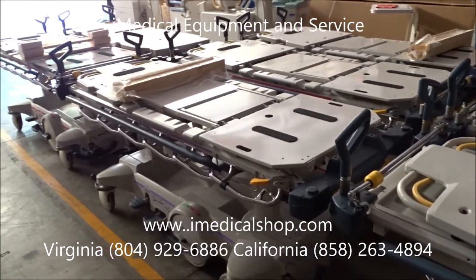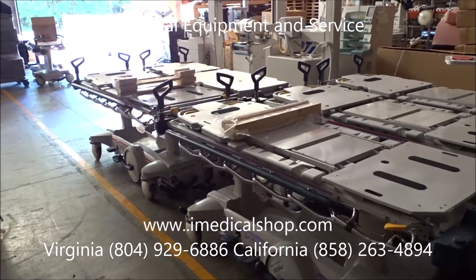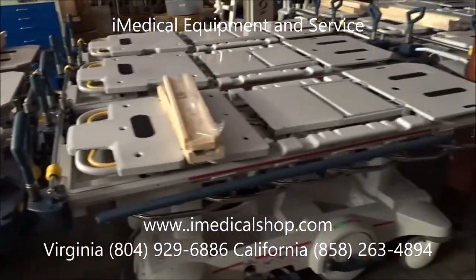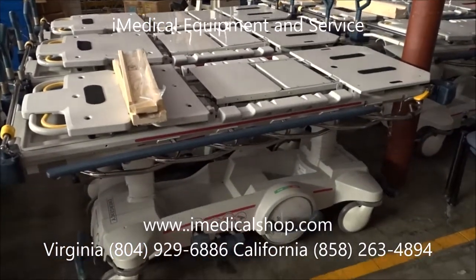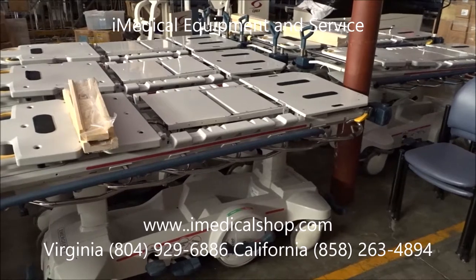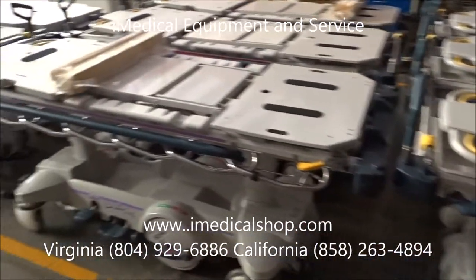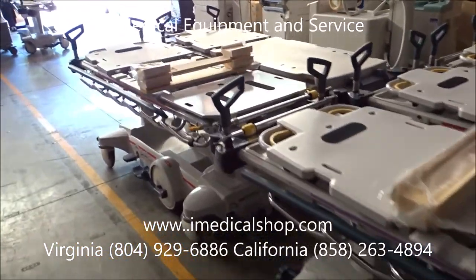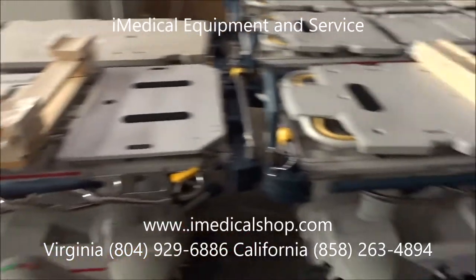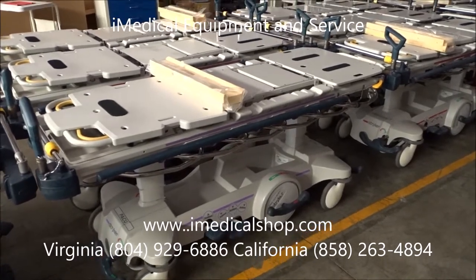We sell over 4,000 stretchers a year made by Hilrom, Stryker, Steris Housestead, and Pedego. If you're looking for refurbished and reconditioned Stryker stretchers — including the 1005s, 1015s, and other models from Stryker, Hilrom, and more — give us a call at iMedical. San Diego, California: 858-263-4894. Richmond, Virginia: 804-929-6886. You can get pricing and more information at www.imedicalshop.com.